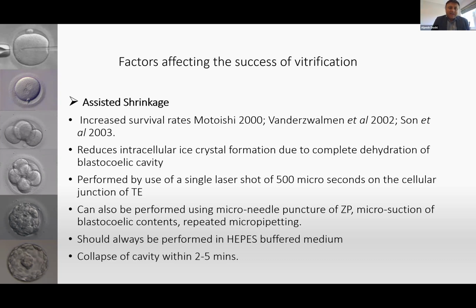Please validate your laser. A laser is a heat gun. So if you have not used lasers in your lab setting, or you're a bit inexperienced at it, please get some further advice on what pulse to use on your laser, rather than any high pulse. Because ultimately, if you use a very high laser pulse, it will lead to irreversible heat damage, which can disintegrate your embryo. So you really want to make sure that the laser pulse that you're using has been validated for use.